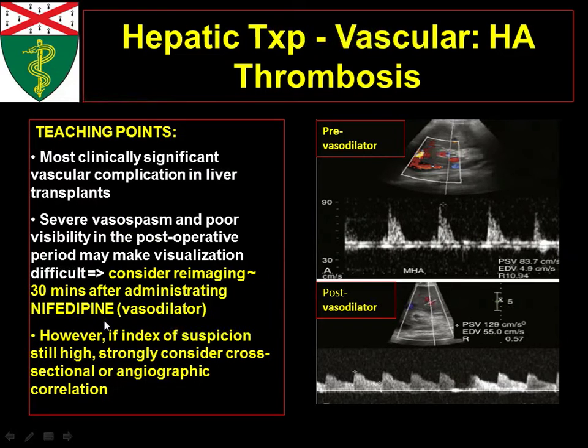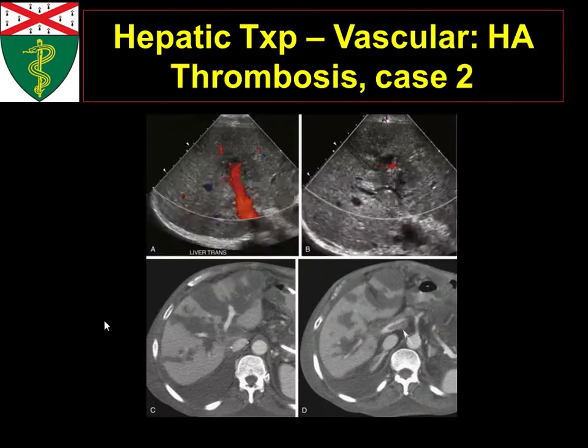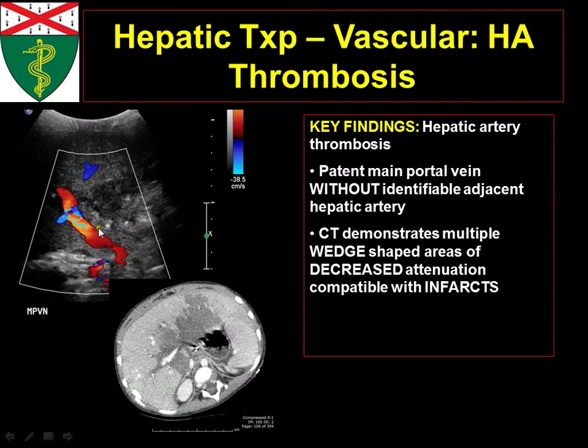However, despite giving nifedipine, if you don't see any hepatic arteries, they'll ask for an angiogram maybe, or they may take them back to the OR. And so this patient, for example, this pediatric patient, they didn't see the hepatic artery. You bet they gave nifedipine before they decided to take him back to the OR and fix that problem.